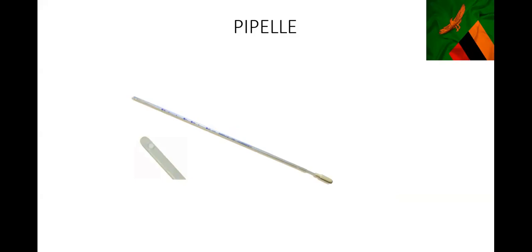This is a Pipelle, used for getting an endometrial biopsy as an outpatient procedure. Patients come to the clinic and we do an endometrial biopsy. You can see how it's shaped like an MVA cannula but much smaller, with a hole in front. This is a Pipelle - you insert it in the cervix, scrape, and the sample comes inside the Pipelle.